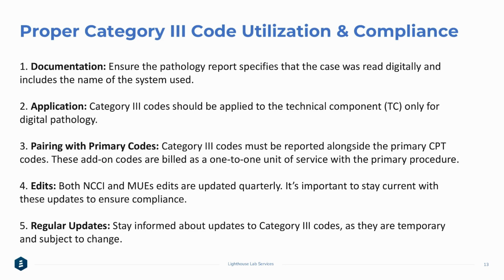We'll move on to the proper Category 3 code utilization and compliance. As far as documentation, we want to ensure that the pathology report specifies that the case was read digitally and includes the name of the system used.